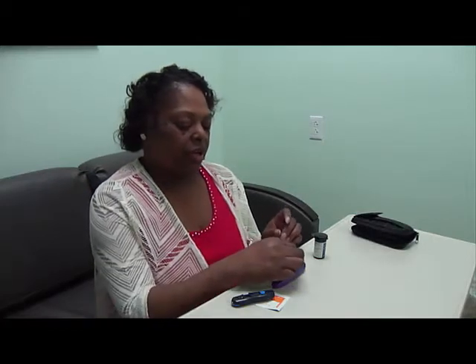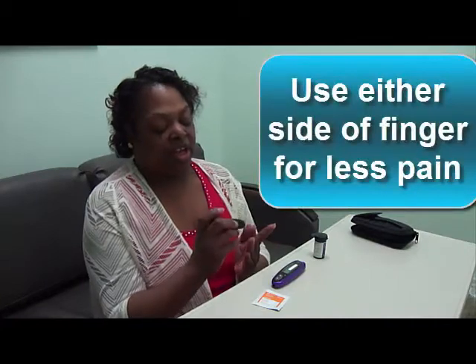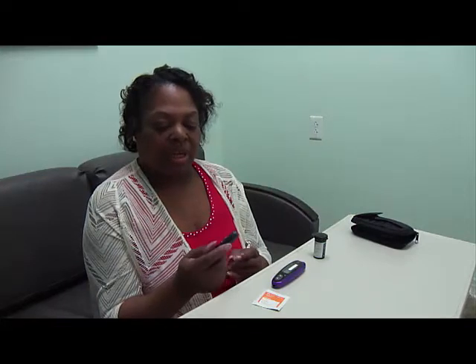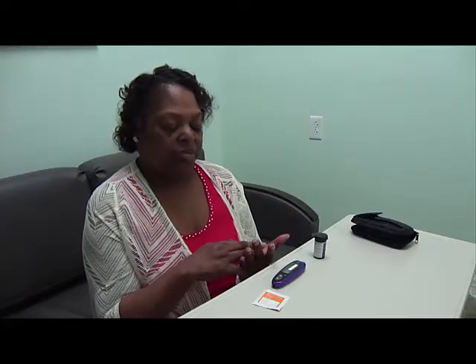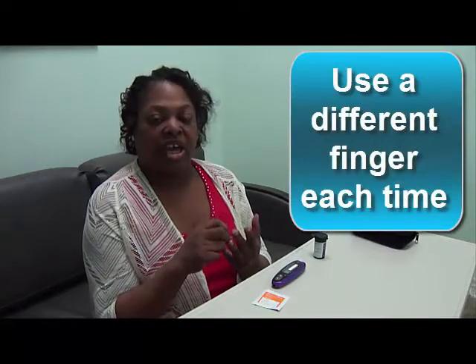And so I'll do the finger on either side rather than in the middle. That's less painful. I keep mine on 4 because that's a comfort level for me. I change fingers frequently because you don't want to be doing the same finger. You end up with a lot of punctures there, and it may get infected. Sometimes when you use the same finger, the blood flow is not there, so you're not getting enough blood, and it won't be a true reading. So you want to do that, and that's how I do it.